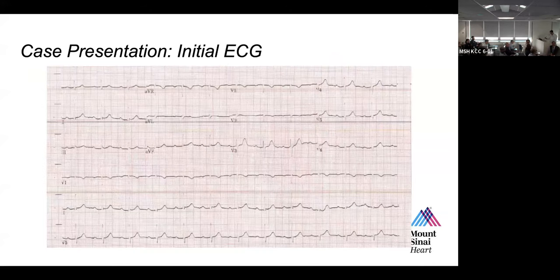This was the patient's initial EKG, which shows normal sinus rhythm, first-degree AV block, otherwise pretty unremarkable. Dr. Stern, sorry, it was scanned in, so the QRSs are a little faint. Something to keep in mind as you then show us the imaging. He's a hypertensive gentleman, but he doesn't have much voltage. So either it's because he's fat or because something else is going on, or because we're just insensitive to pick it up.